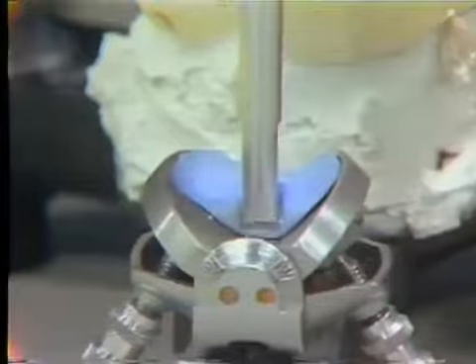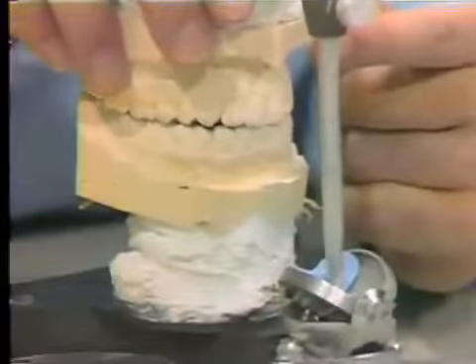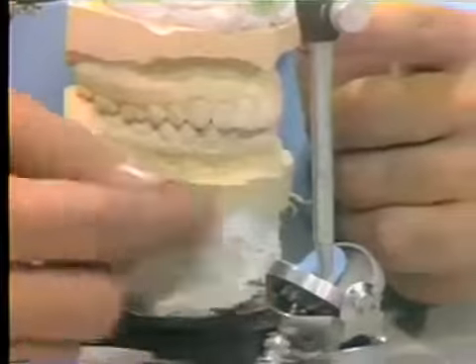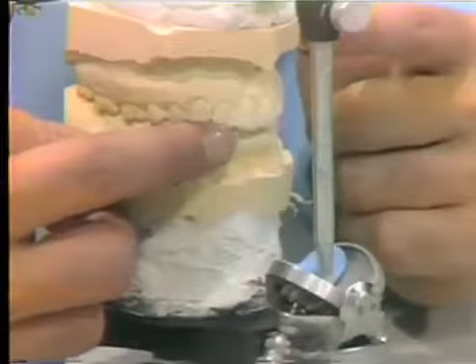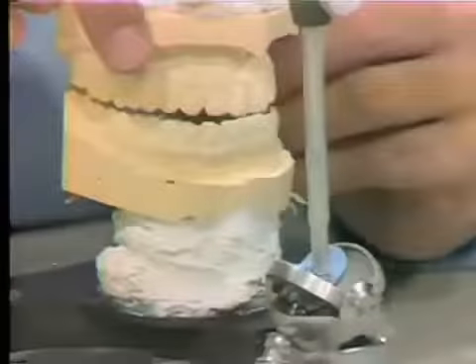And if we look at the incisal edges of the teeth, I'm duplicating this concavity. The incisal pin riding over the acrylic is duplicating the movement of the casts of the incisal edges of the mandibular teeth over the lingual concavity of the maxillary teeth.